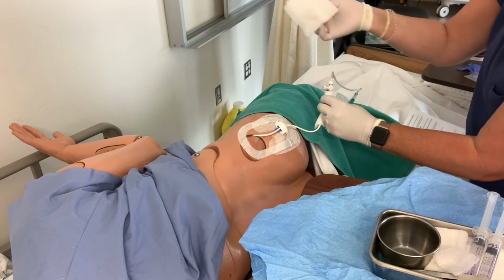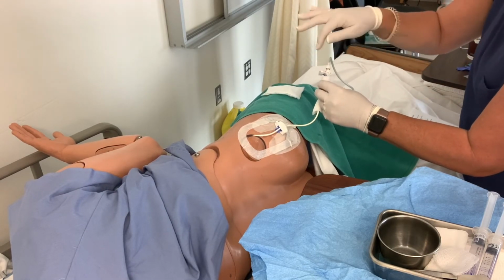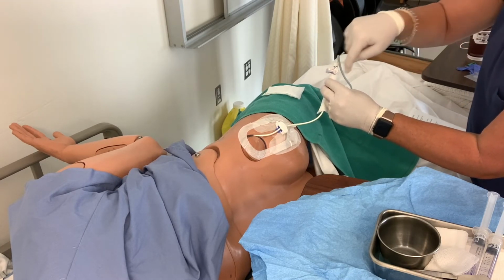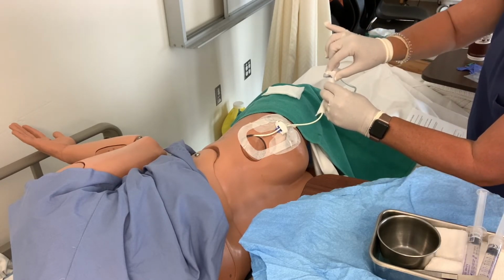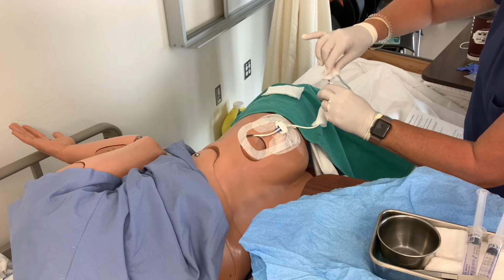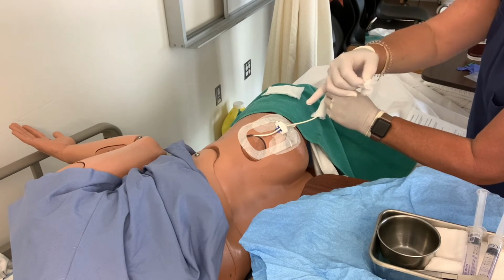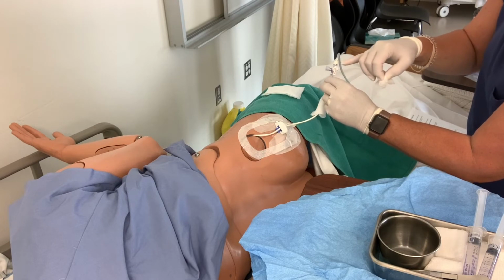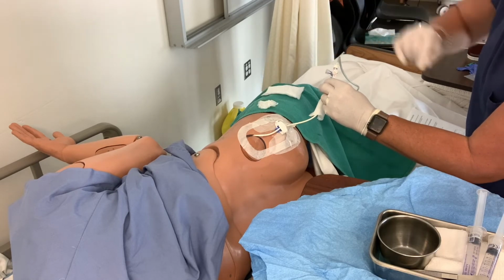I'm going to take a couple more sterile 4x4s and just place them on my sterile towel. And I'm going to say that this connection is dry. So what I want to do is turn the stopcock. I want to turn this here. Remember, don't touch anything. I'm going to take a gauze, and I'm going to turn the stopcock off. And I'm going to turn it towards the patient. So you'll eventually be able to see that. But that is pointing towards the patient. I want the system to be off to him right now. And I have 2 other ports, but that doesn't matter. They're open. That doesn't matter. I'm going to disconnect those, okay? So it's off to the patient, and I'm going to just set my gauze. I can set it wherever. I'll use it probably again.